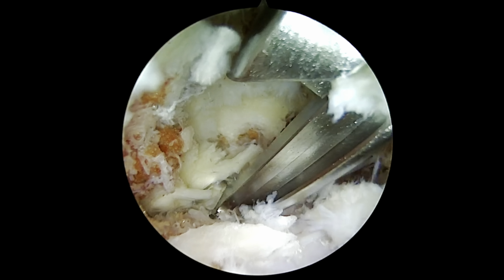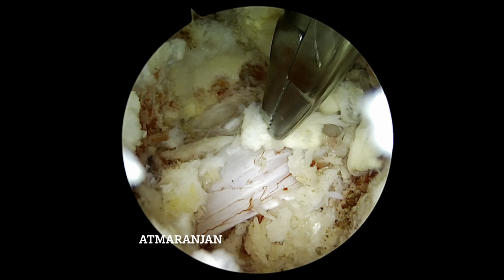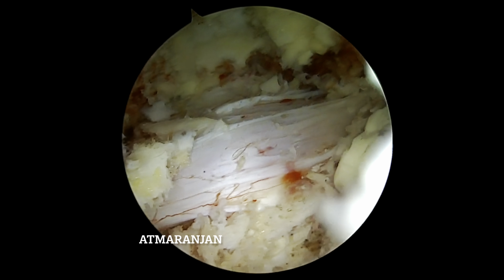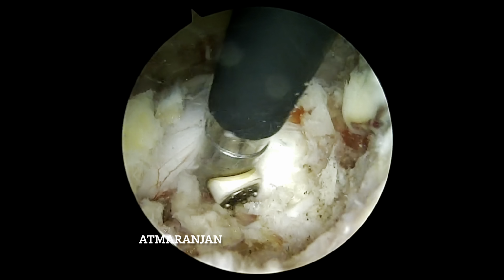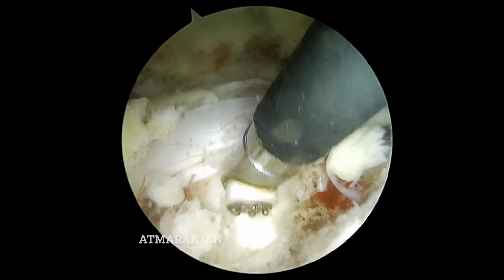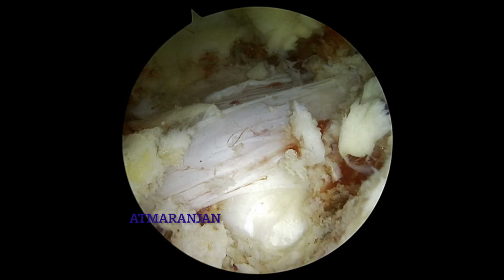Almost the medial border of the SAP has been excised. The contralateral disc and the ipsilateral disc are well visible. Radiofrequency probe is very handy in biportal endoscopy for soft tissue clearing, making the area more visually augmented. So we can very well clearly identify the disc space here.